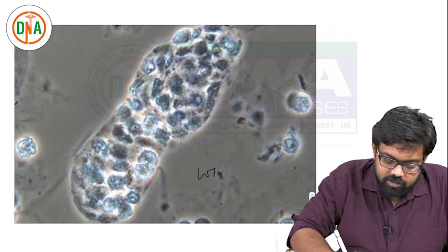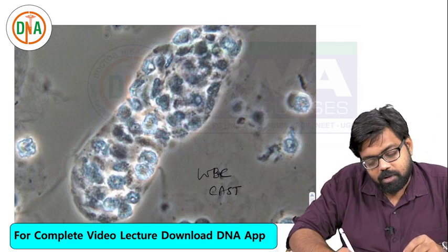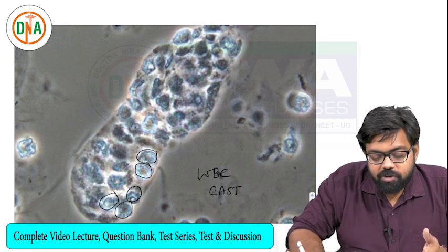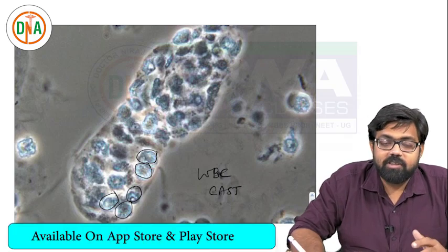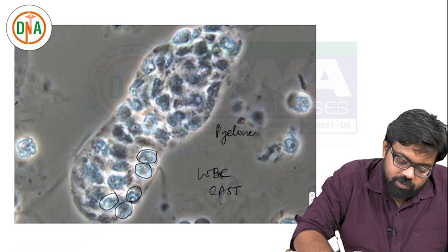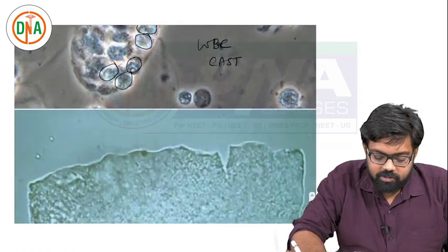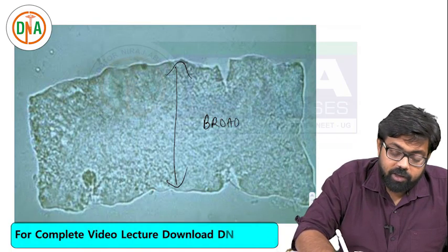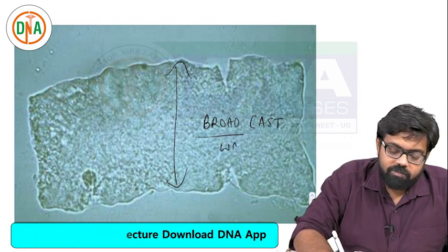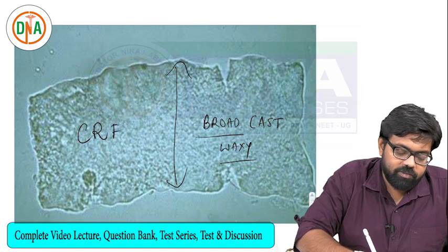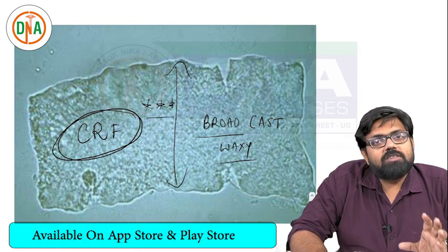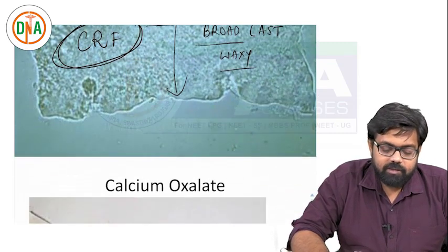A WBC cast means normal protein with WBCs studded along it, which is more in favor of tubular inflammations like pyelonephritis. Comparing this cast with the next one - it is looking much wider with sharp angles. This is called a broad cast or broad waxy cast, which is characteristic of and specifically seen in chronic renal failure. This has been asked repeatedly as an MCQ. This larger-dimensioned cast seen in chronic renal failure is called a broad cast or waxy cast.